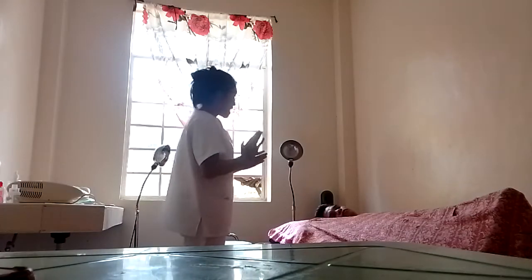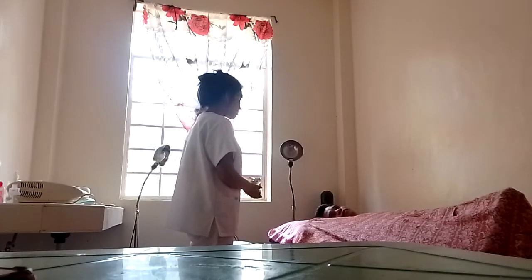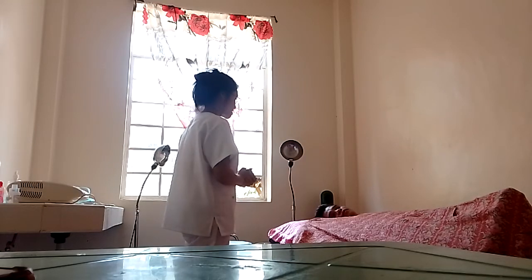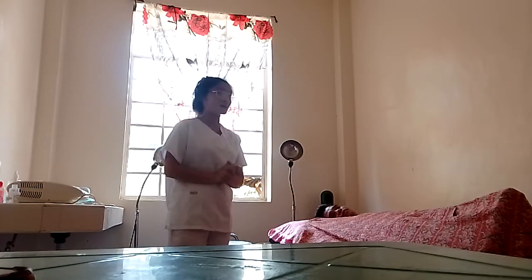Okay, so hi sir, good morning. I am Giselle, and I am your nursing assistant for today. And now we will do oxygen therapy. So what is it?